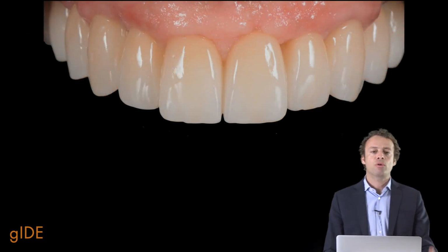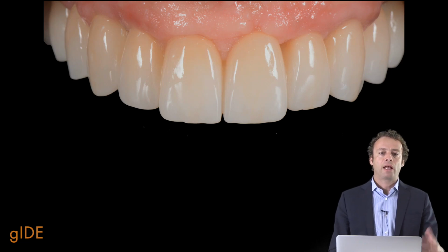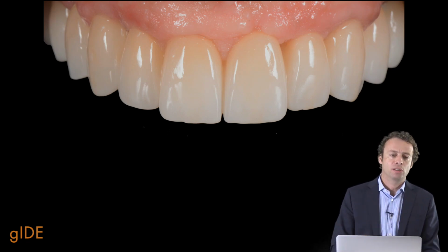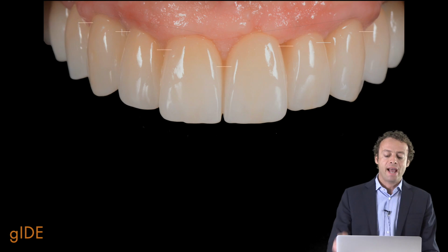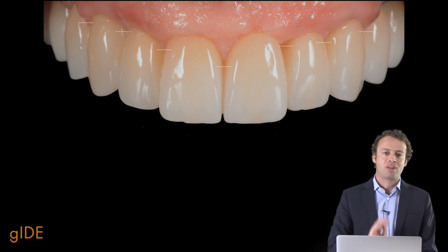And when I screw it in the mouth, this is exactly the result that I achieved: a good blending, a good combination of this framework and my profiles with the soft tissues. And this is exactly what I want for my patients, in particular when we work with the all porcelain approaches. And this is also the key factor in order to have a stable result.